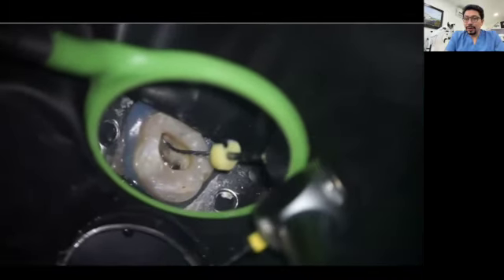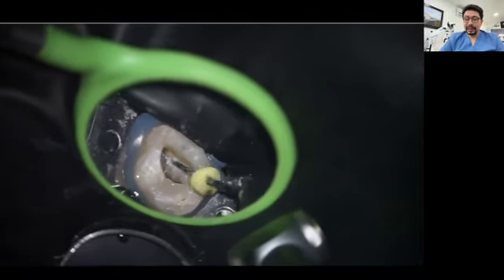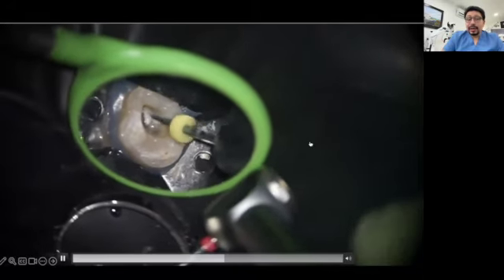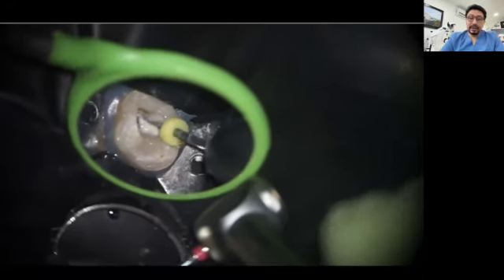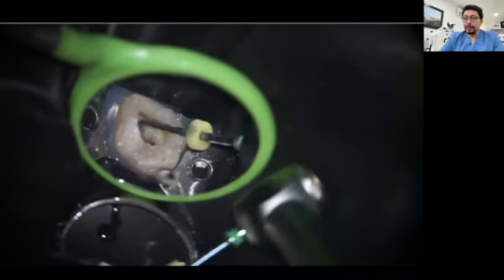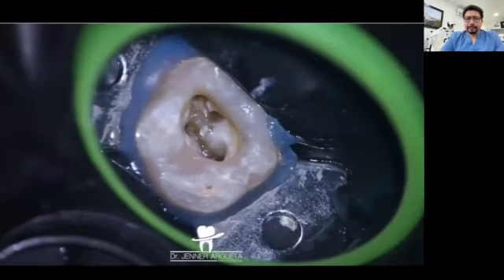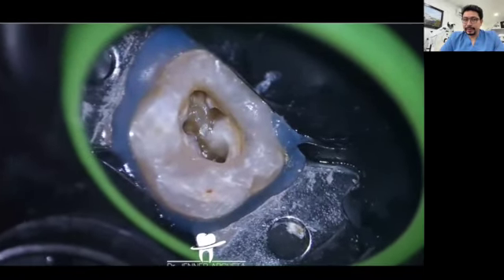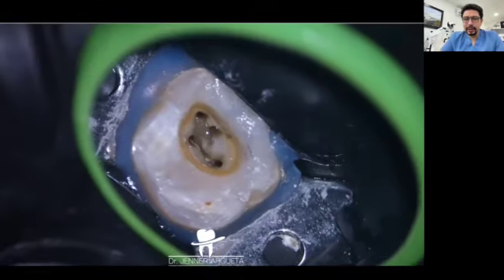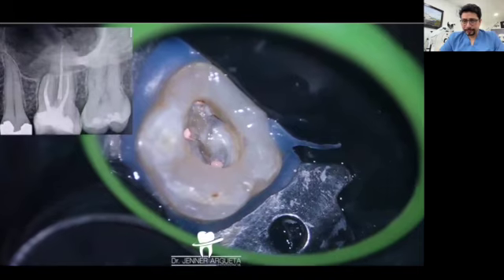You are seeing all the process in which we went from a totally non-restorable tooth to a clinical situation in which you can think, okay, that tooth is possible to be saved. And we were able to save that tooth because of the help of magnification. So what we want is to provide help to our patients. You can see that we were able to clean the root canal system. We were able to reconstruct that molar.